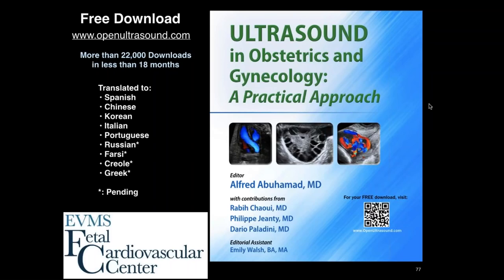When evaluating late first or early second trimester cardiac views, do you find that patients often make decisions based on these findings or wait for more formal fetal echo later in gestation? Very good question. I think it depends on what you see. If I see a hypoplastic left heart with all the characteristic features at 13 weeks, and I document it by color and grayscale and all the things, and I can counsel the patient that this is hypoplastic left heart, patients then make decisions based on that. If it's a minor abnormality, we always wait for follow-up.